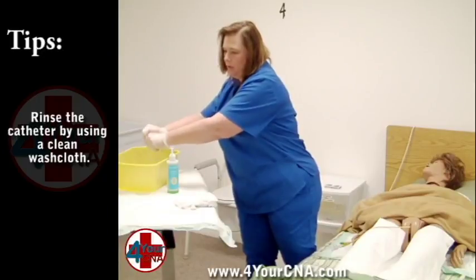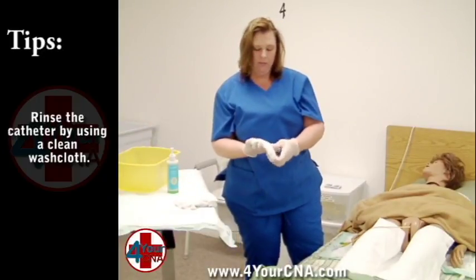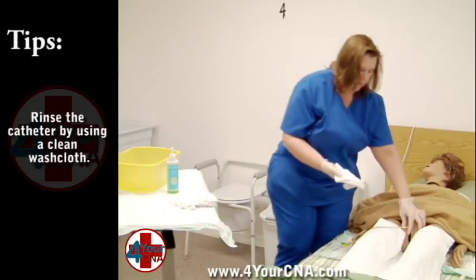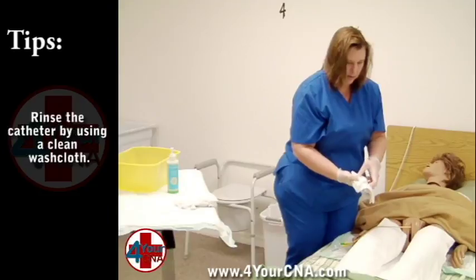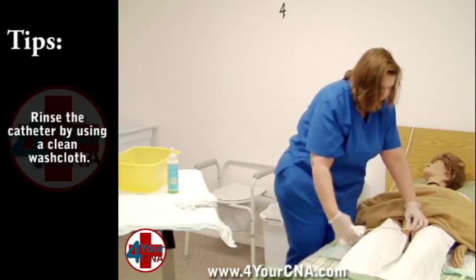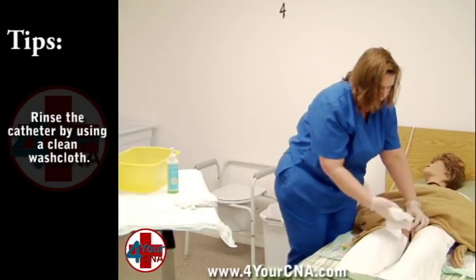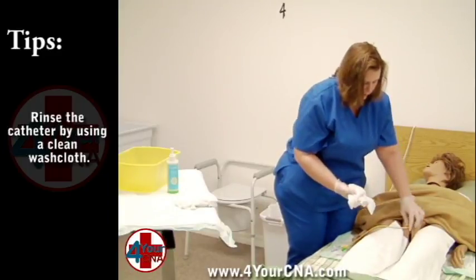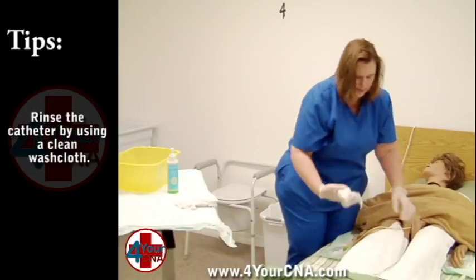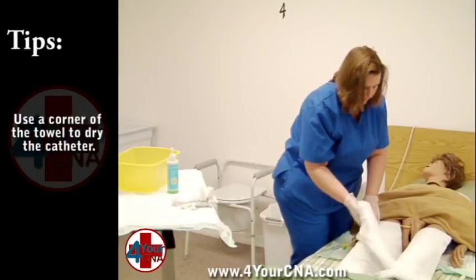Ring the second washcloth out and rinse the catheter the same way you washed it while holding the catheter in place. Use all four leaves, wash away from the body and fold the corners over between strokes. Set this washcloth aside when finished. Use a corner of the towel to dry the catheter the same way.